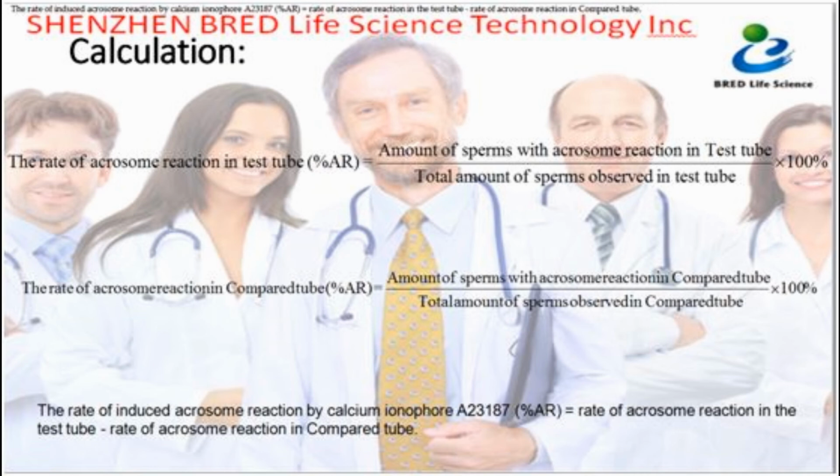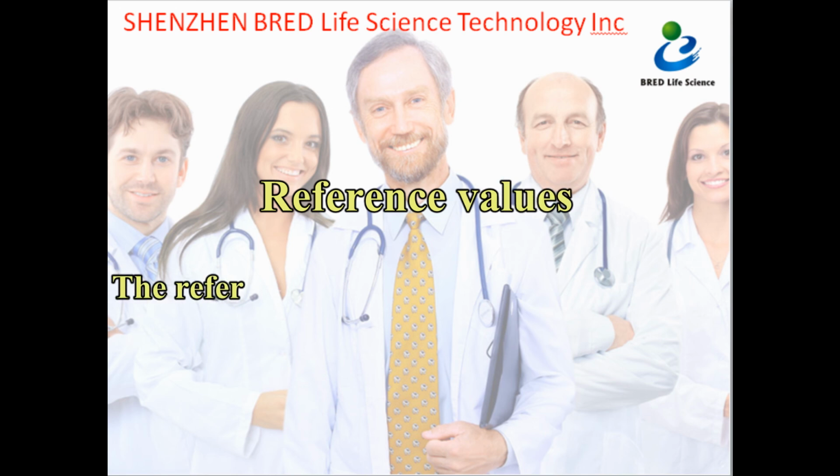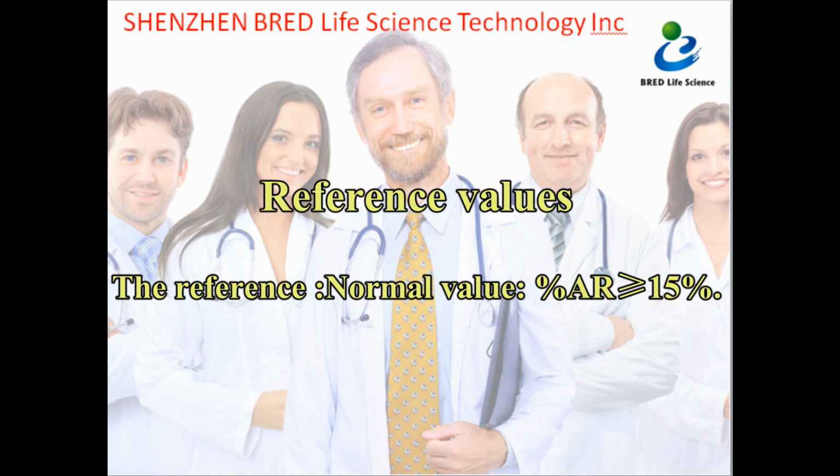The rate of induced acrosome reaction by calcium ionophore A23187, percent AR, is rate of acrosome reaction in the test tube minus rate of acrosome reaction in compared tube. Reference values. The reference normal value, percent AR, is greater than or equal to 15%.